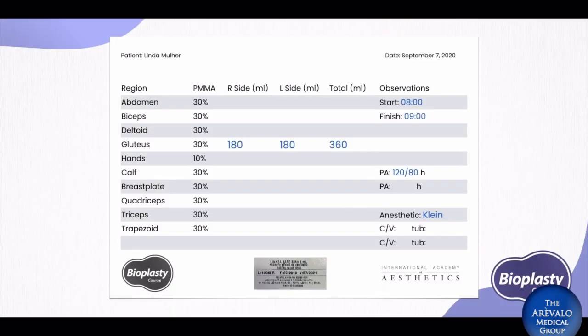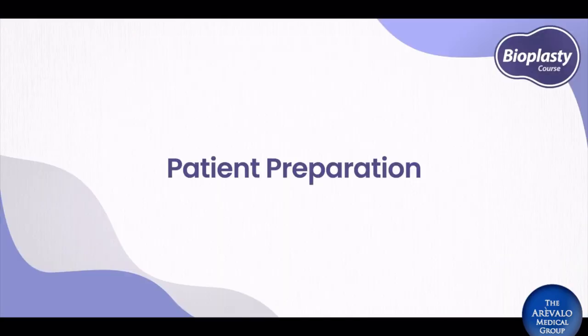Always remember to fill out the patient's form. Write the amount of product applied on each side and stick the product identification seal. These measures can avoid future hassles. To prepare the patient, wear a disposable cap and apron.